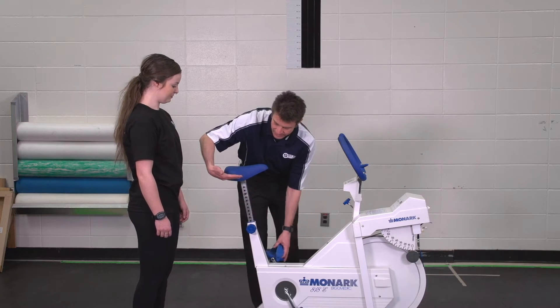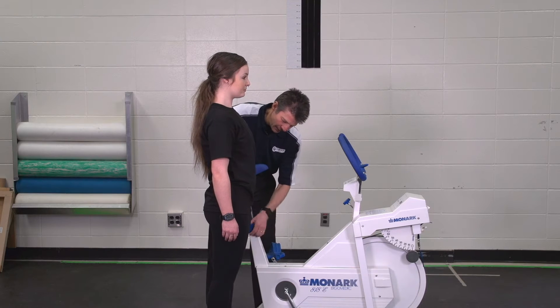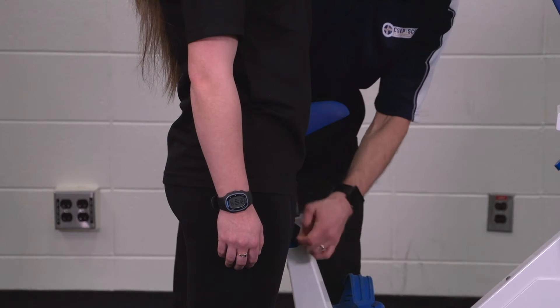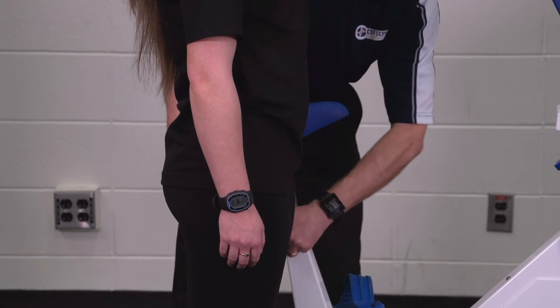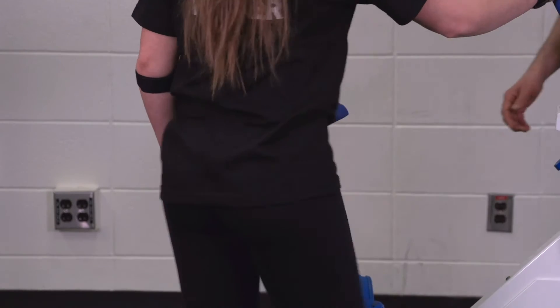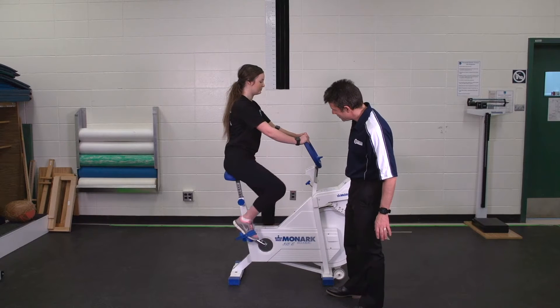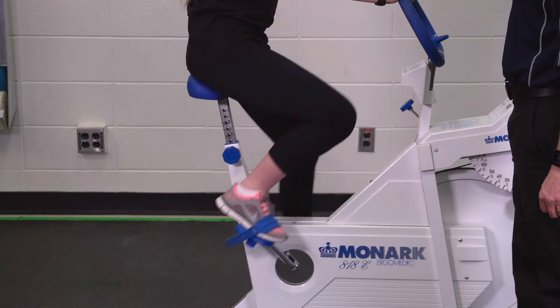If I can get you to stand next to the bicycle — I'm going to drop the saddle to about your hip height, that looks good. Okay, if I can get you to step on and just do a couple of pedal strokes — that looks good. Your leg is almost fully extended, still a little bit of a bend in there.